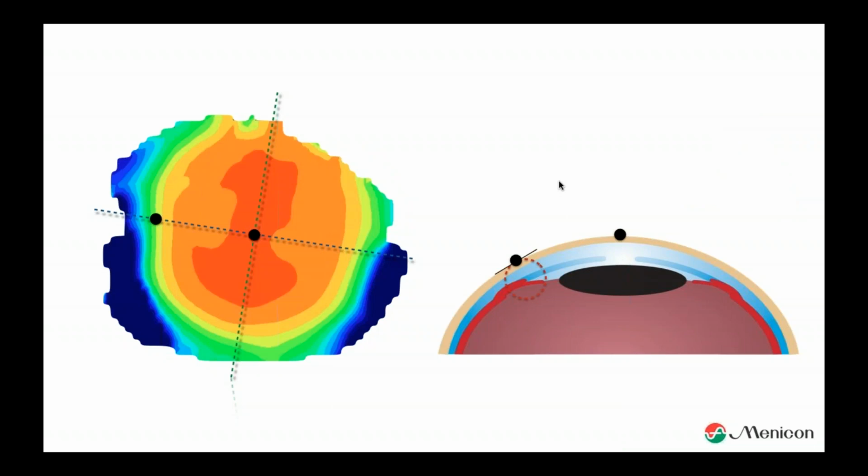If you look at the tangential map, it's a very valuable map. You see, it's very irregular, and we see a kind of astigmatism, but it's not as clear as in the sagittal map. What is the topographer doing now? Well, for your information, now the topographer is looking very locally. In other words, it is not taking into account the sagittal height anymore, the center part of the cornea.